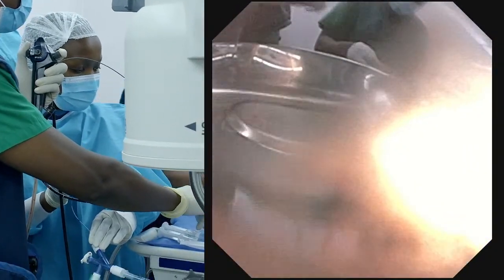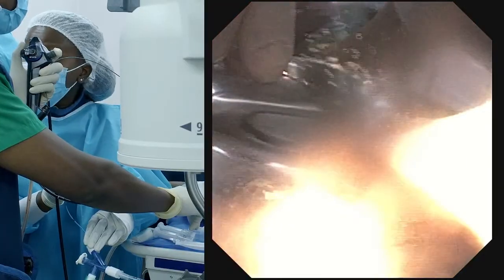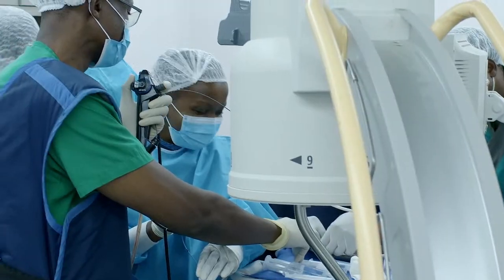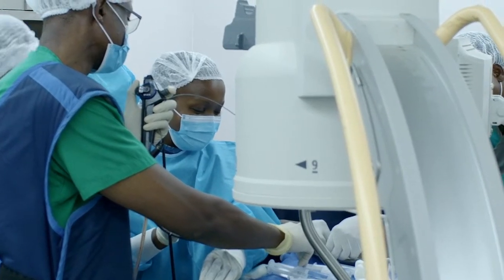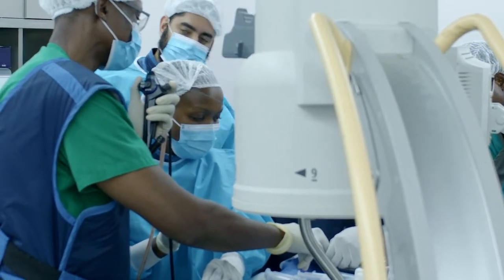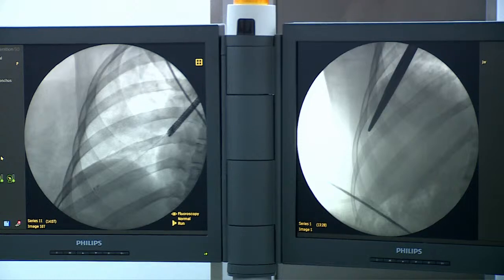When you did your first one, I stepped on your foot so that you don't release the specimen. That's a good habit. You can release it now once it's in the water, so that it thaws, because we want it to thaw in there. Okay, good. Thank you, guys.